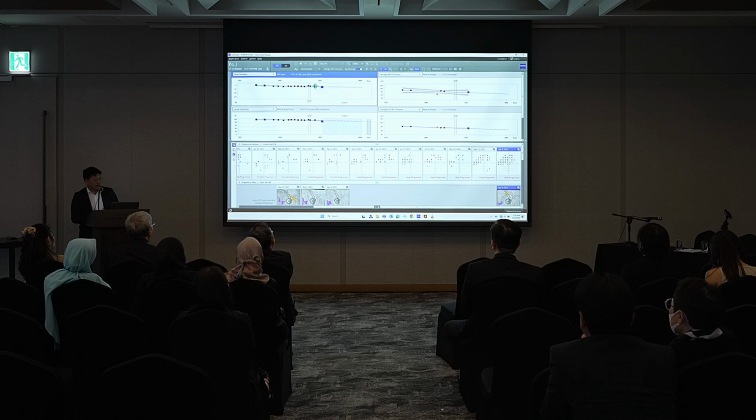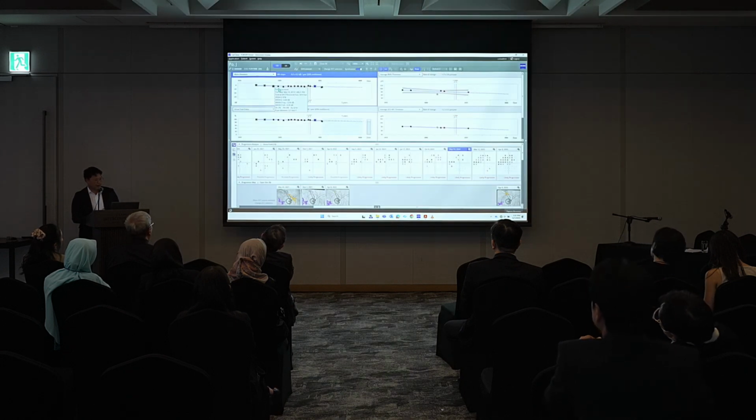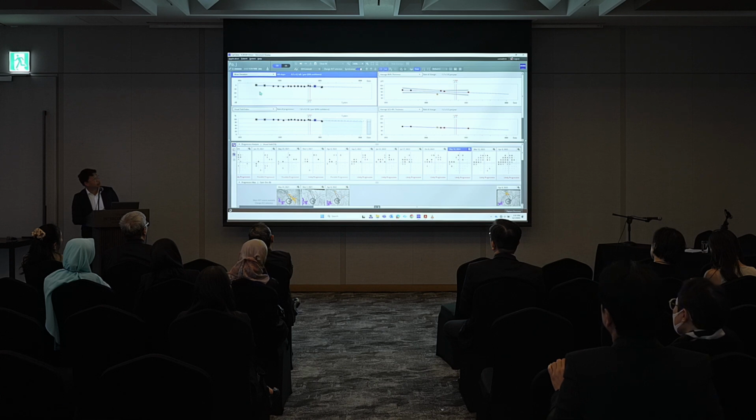And, for example, in this patient, you can see that things are getting worse in terms of their visual field. You can see that they're starting to go off a cliff. So whereas the eye has been relatively stable this whole time, you can see that things are now starting to decline as the intraocular pressure is creeping up and previous glaucoma surgery has failed. So if you've got a nurse that you can trust, you can basically ask your nurses to do this.